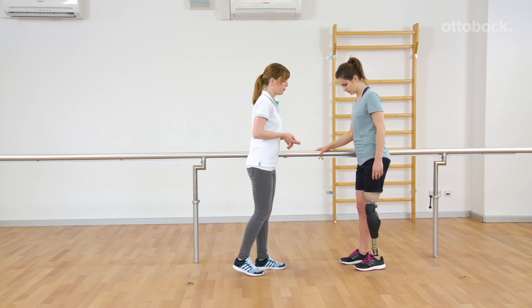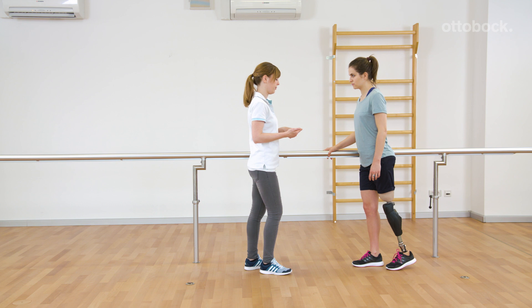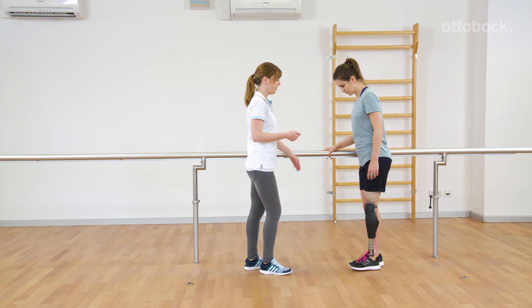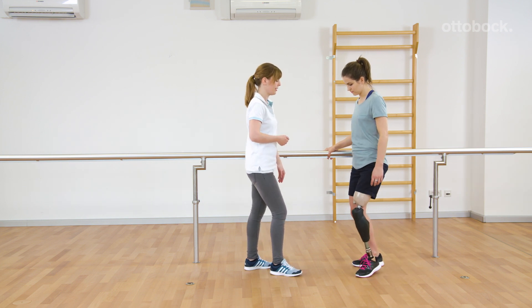Switching back via the same movement pattern. During bouncing, the knee has to be extended. Three times bouncing and unloading. After one long beep, a shorter beep confirms the switch back into the basic mode.